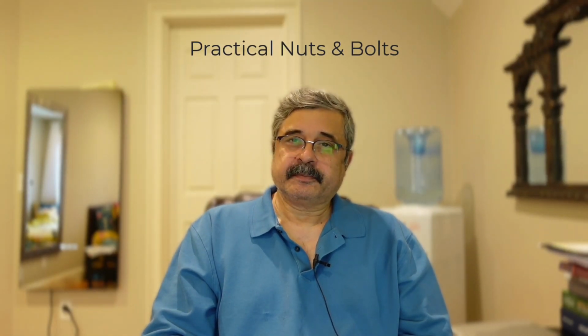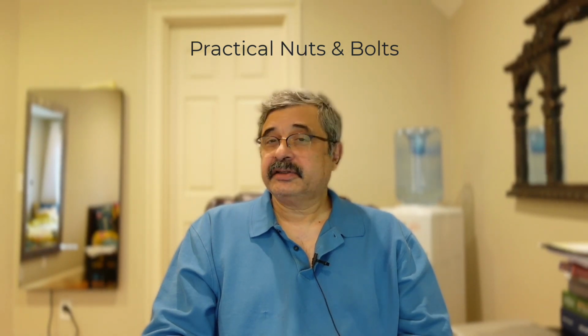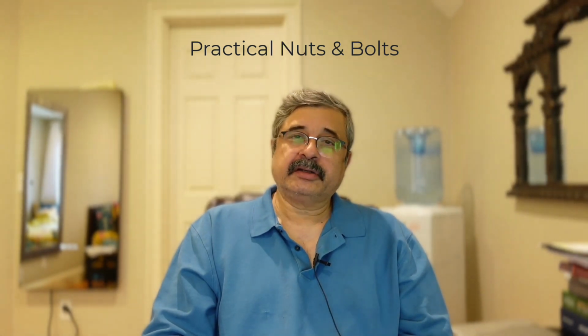You should have the ability to select the energy, change the energy level, and use the shock button to either cardiovert or defibrillate when the skin pads are being used, or to select the energy and tell the cardiac surgical team to use the cardioversion paddles to cardiovert or defibrillate the patient. This is the practical nuts and bolts of the LifePak monitor, and I hope you enjoy this session. Thank you.